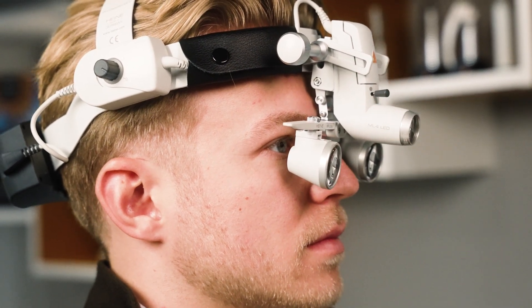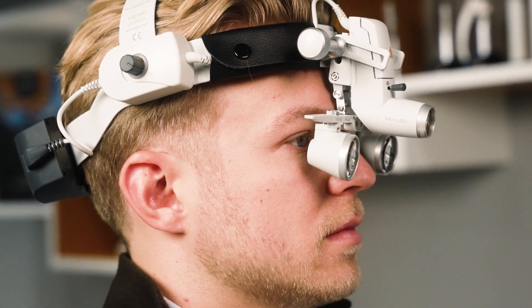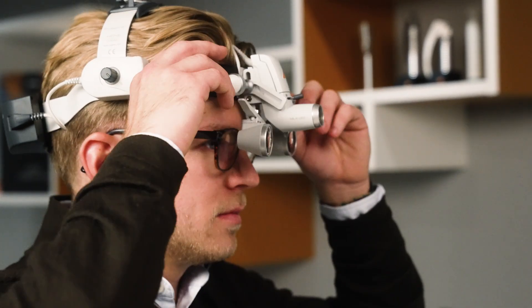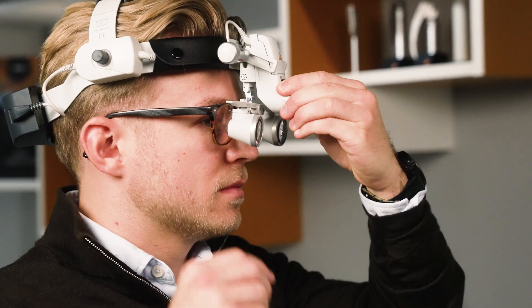Otherwise the parallel alignment of the loops and the light from the beginning can be lost. Make sure your eyelashes do not touch the loops. If you wear glasses, position the loops as close as possible to the lenses without them touching. To finish the setup, tighten the main fixation screw.